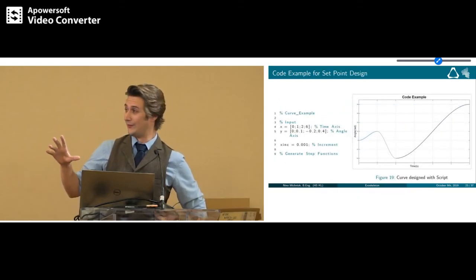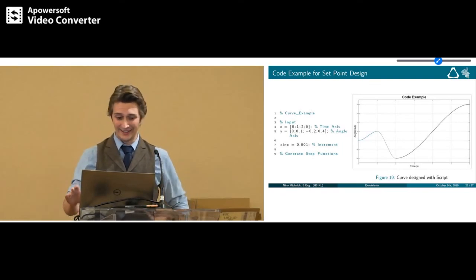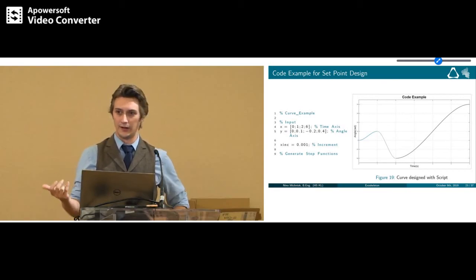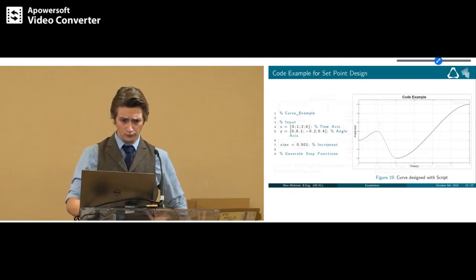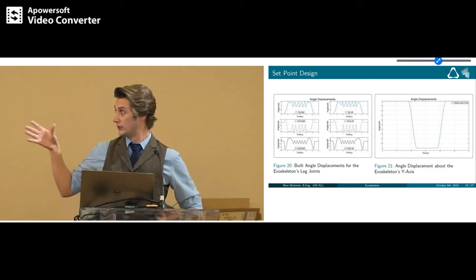Additionally, to avoid these discontinuities I had already had and didn't want to have again, I wrote a little script. This is a code example where the user just has to input the location and the value of the extrema and an increment. And what the script does is generate a third-degree polynomial in between. So I had this continuous motion guaranteed.